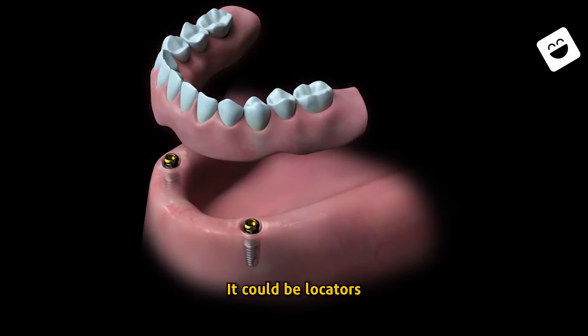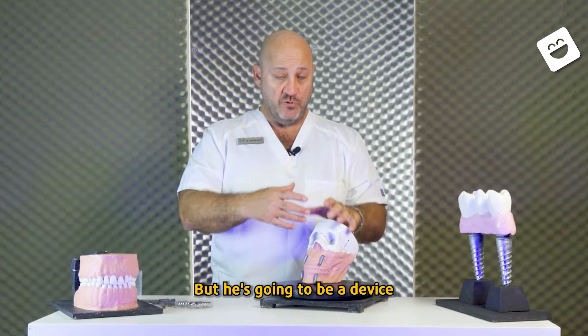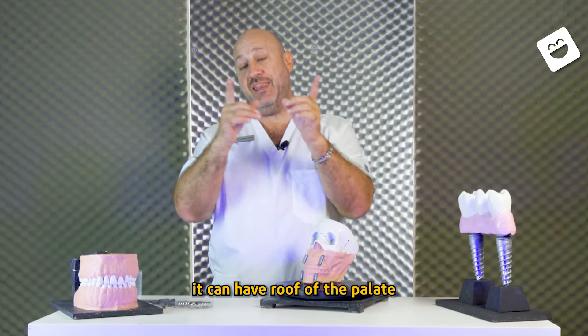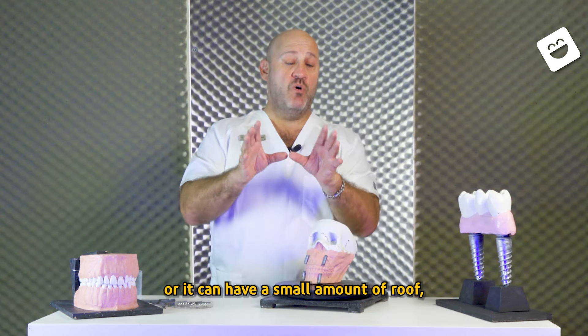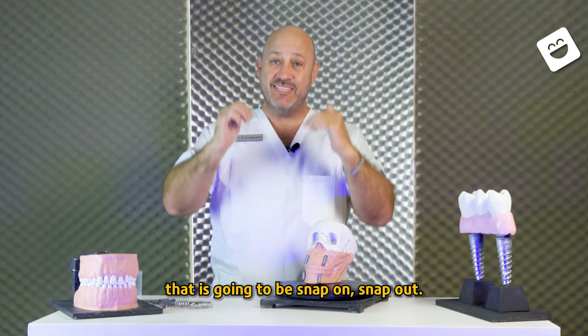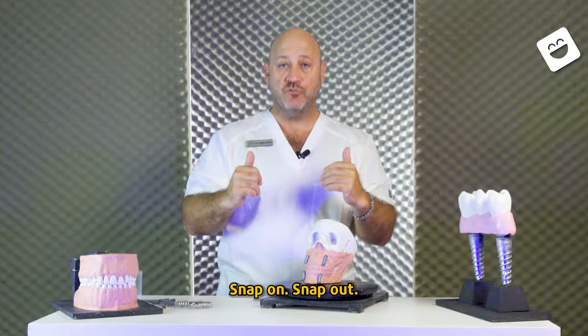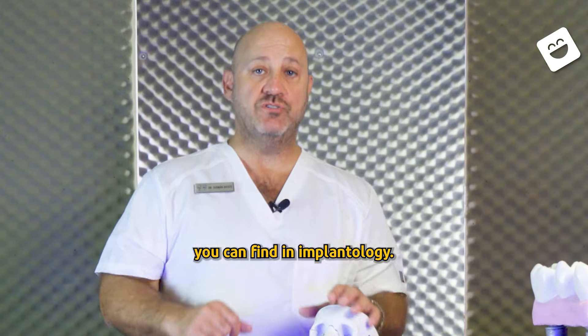It could be locators — they're going to be like a junction that is going to be strong, but it's going to be a device that probably can have a roof of the palate or a small amount of roof of palate. At the end, it's going to be a device that is snap-on, snap-out. That's the most basic thing that you can find in implantology.